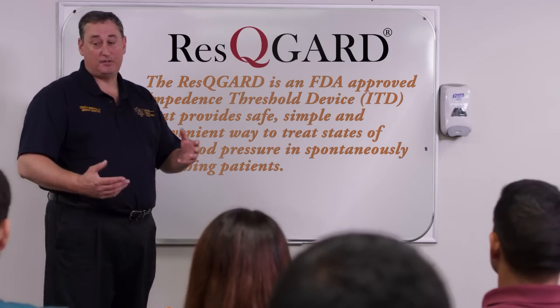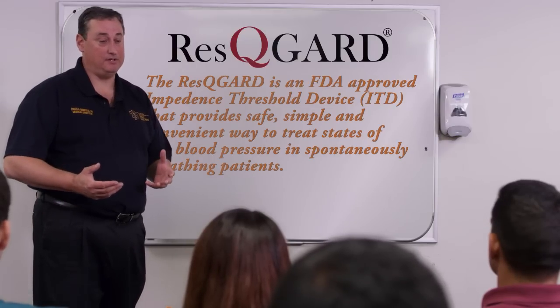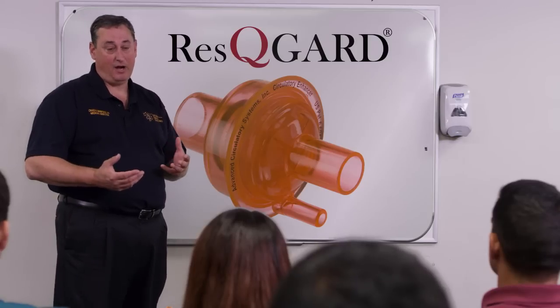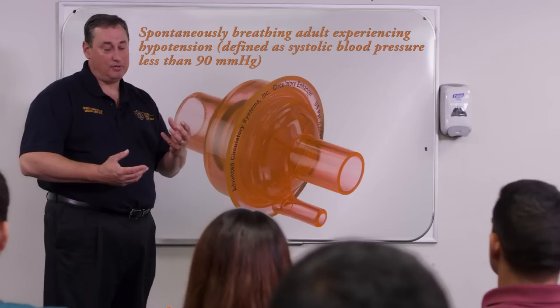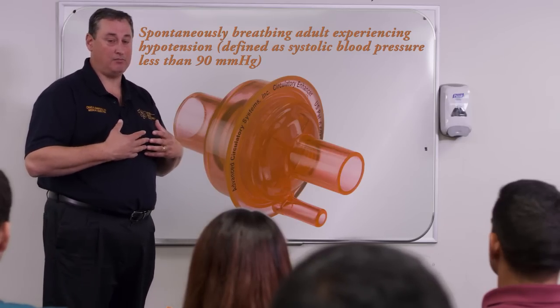Today we're going to introduce the ResQGARD. This is a device that can be utilized to help increase a patient's blood pressure. When we look at this device, it's a simple one-way valve that can be put on a patient who's spontaneously breathing and allow that person to breathe against this valve that increases the negative intrathoracic pressure.